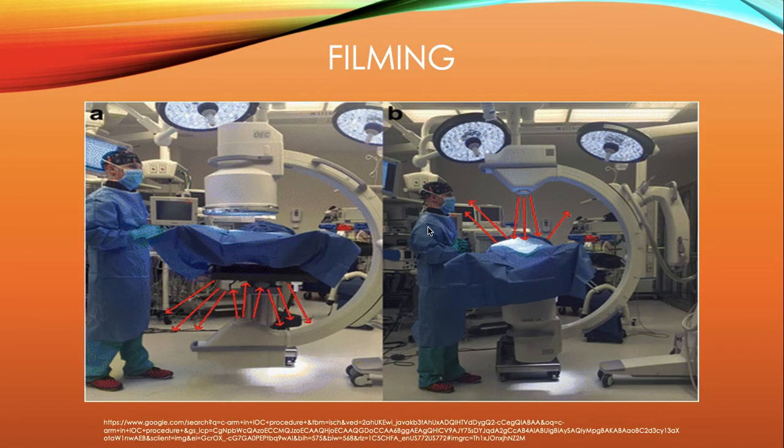So filming, like I said before, the patient is in a Trendelenburg position. The C-arm will be positioned over the gallbladder within the right upper quadrant to include the bile ducts. Also, if you're unable to put the patient in a Trendelenburg position and they are supine, it's recommended that you angle the C-arm about 15 degrees because you want to get the gallbladder away from the spine.